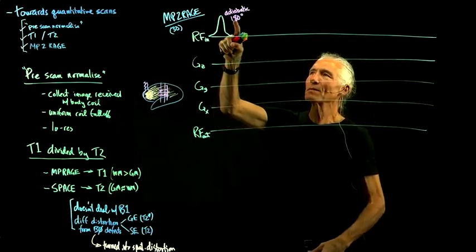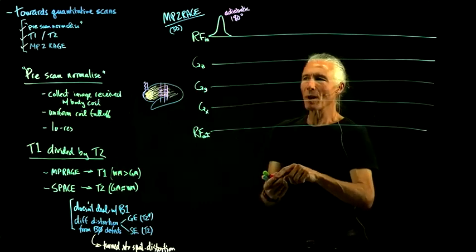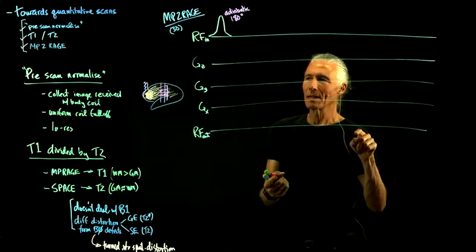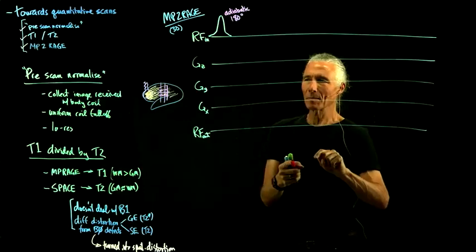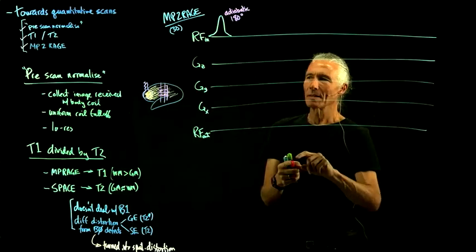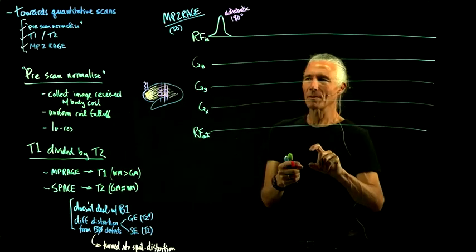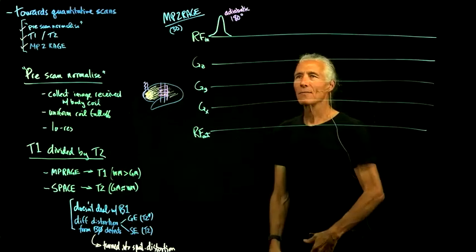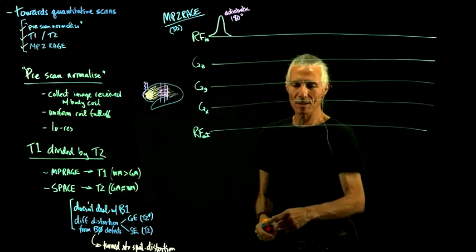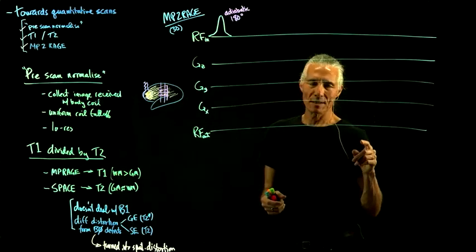And what's an example of a pulse like that? One way of doing it is, instead of just playing out this little blip of a pulse, like a sinc pulse, where you make little variations in the transmitter amplitude, and when you Fourier transform it turns into a band of frequencies, instead of doing that, if you're trying to invert, you can just slowly ramp the frequency of the transmitter.